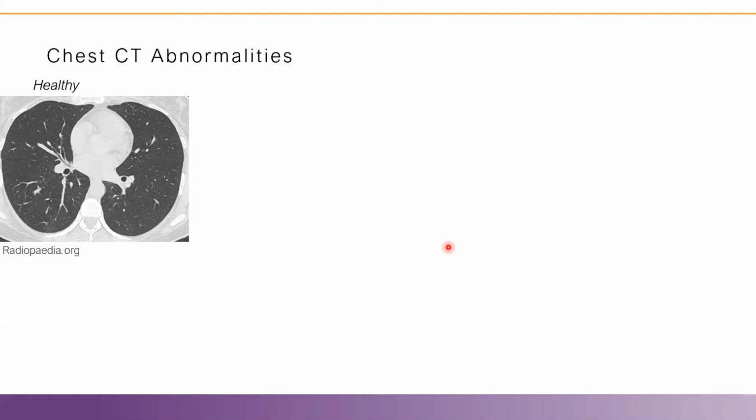And so there's very large data sets available for COVID-19 chest X-rays out there. But I'm skipping over planar X-ray today in favor of chest CT because chest CT provides 3D high-resolution images of lungs and in most cases enables a deeper understanding of the pulmonary pathophysiology. So I'm first showing here a healthy image in the axial plane for reference for anyone who might not be familiar with looking at chest CTs.